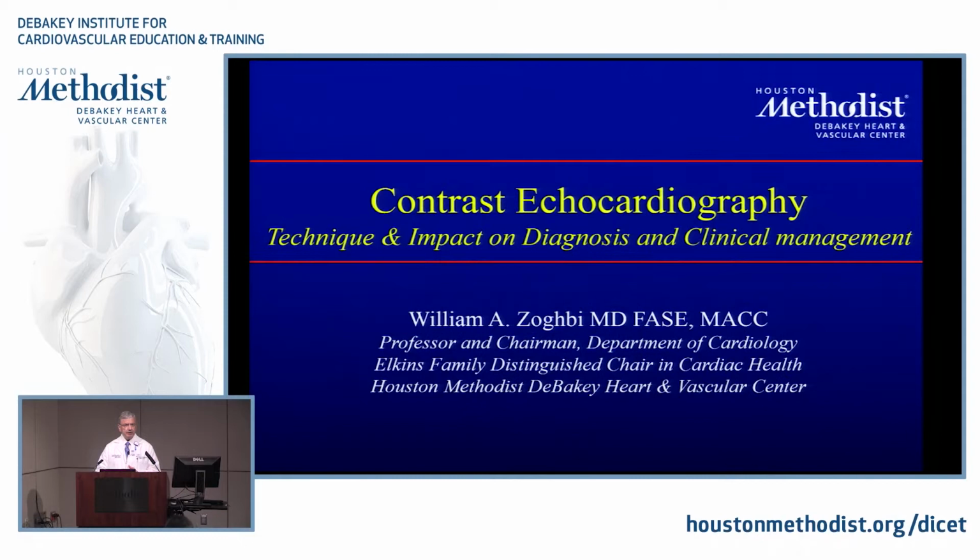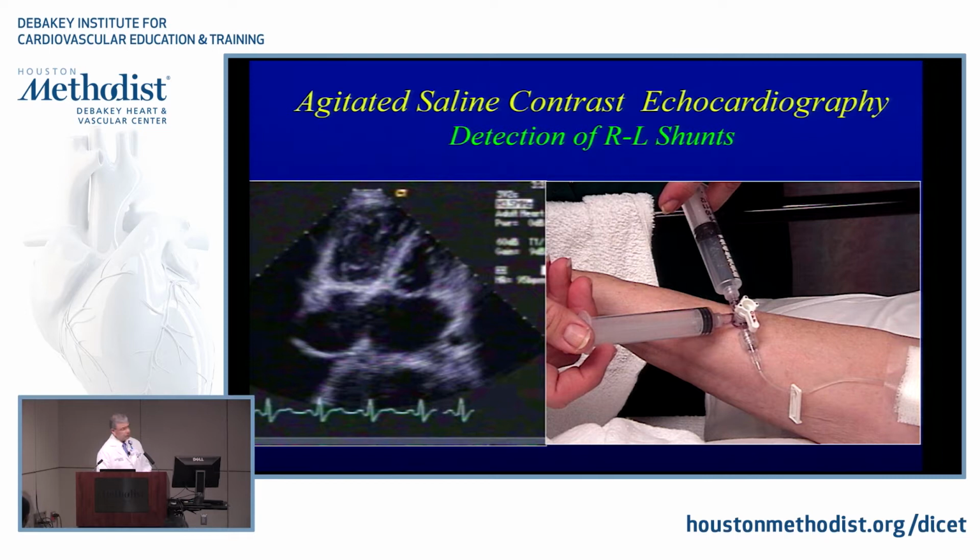And let's hope that we can actually put things in perspective today of where is contrast, what are the agents, what are the pros and the cons, where can we use them. And I would start usually with the conventional agitated saline contrast, because it still has, and it definitely has, a place in cardiology.